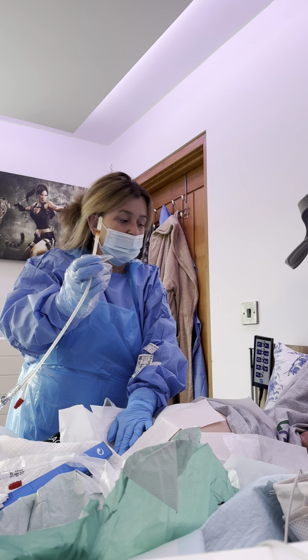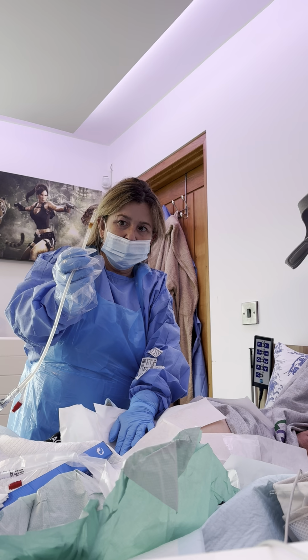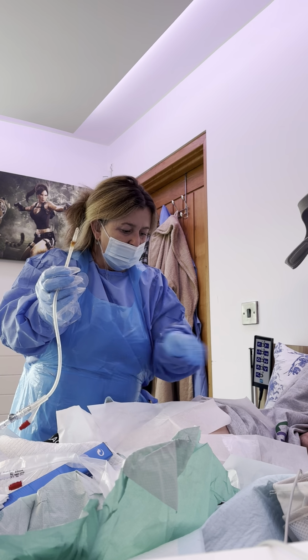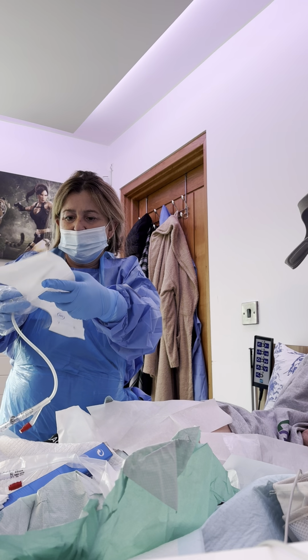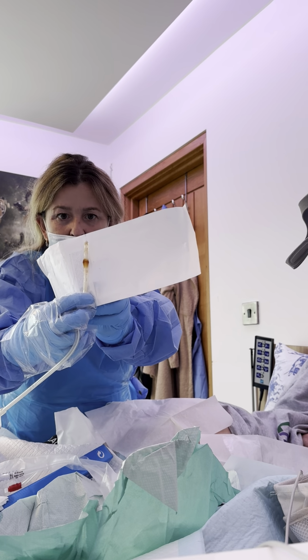Again, the balloon. Have you seen that? I can't really bring it over. The balloon's fine? Have you seen the balloon? No. It looks infected around the balloon. I wish I could show you, but actually I can show you. I'll show the camera. Can you see that?